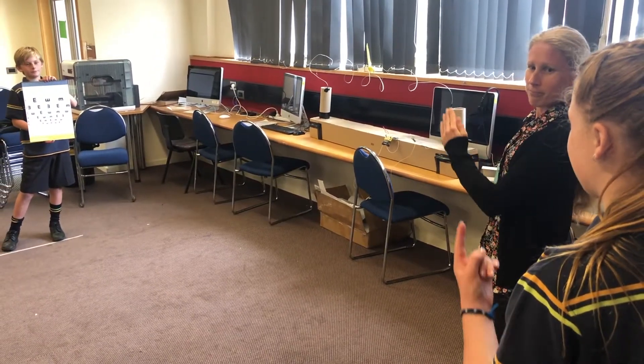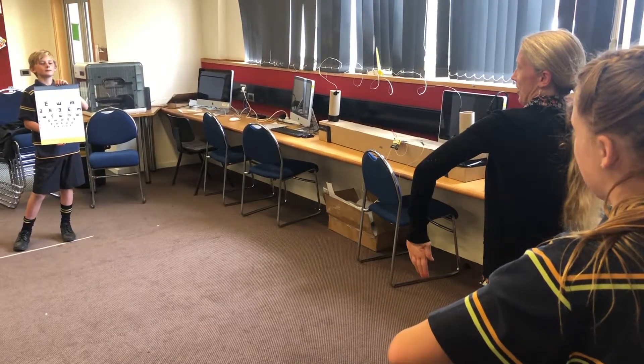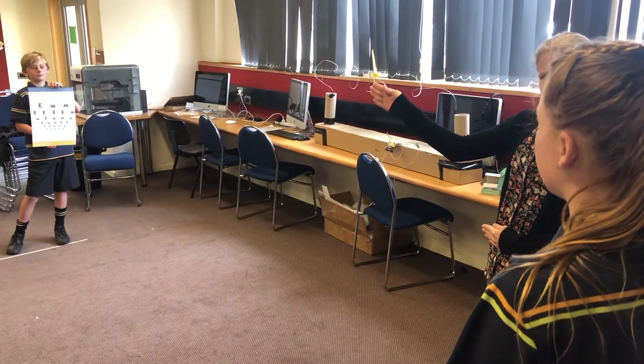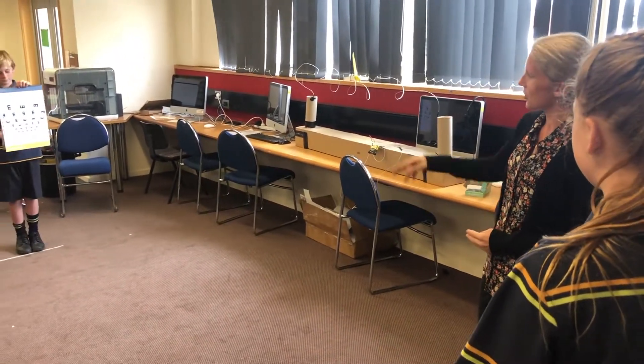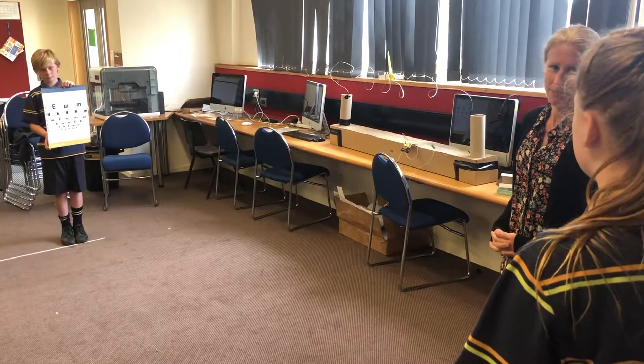What about the next one? Up. And the third one? Down. Perfect. So you're always going to start on the left side of the chart by the red numbers, start from the top of the chart and go down. There are going to be four tests, so you go all the way through the first one, turn the page, and go on to the next one.